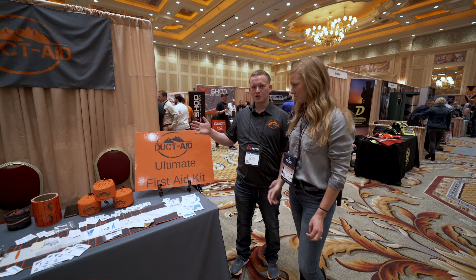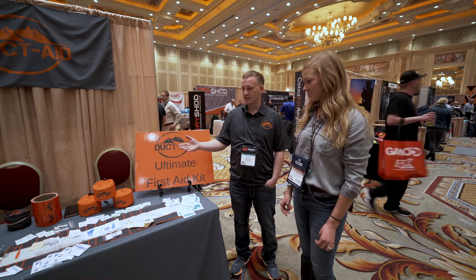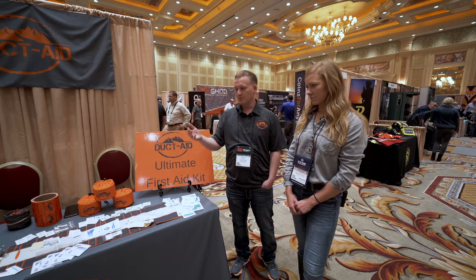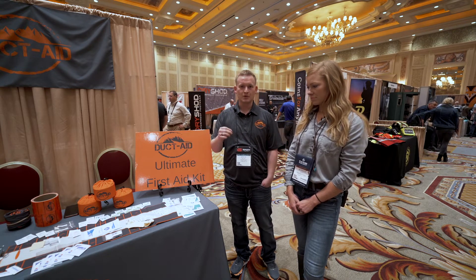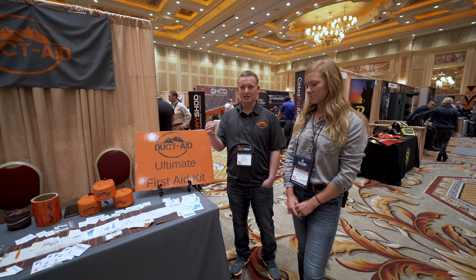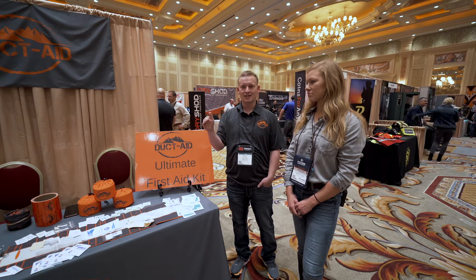So DuctAid, we're this new first aid company. We've designed a revolutionary first aid kit and it's based around a medical grade duct tape. Everybody has duct tape that they keep in their backpack, and if they get cut or have some kind of injury, they love to grab the duct tape and tape up whatever's going on. The problem is the FDA has said that it's actually not good to put that adhesive on your skin, especially over an open wound.